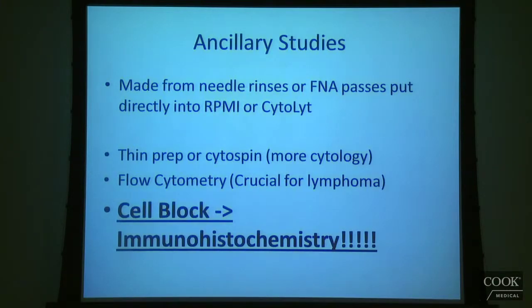So you'll sort of do what we call a needle rinse. You'll rinse out the syringe and needle, and you'll clear out any little bits of tumor or any individual cells into that solution, and you can do ancillary studies with that as well. So yeah, either dedicated passes that you squirt right into the solution, or else you rinse the needle. That's what you can use for these ancillary studies.